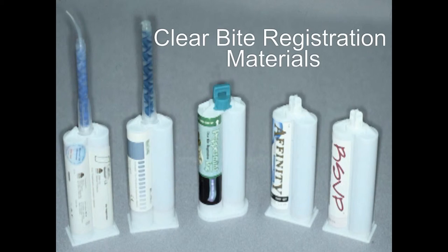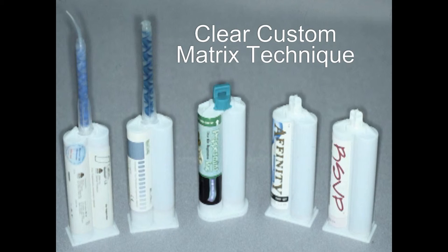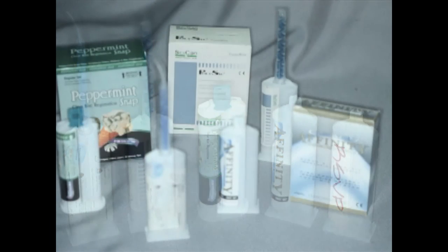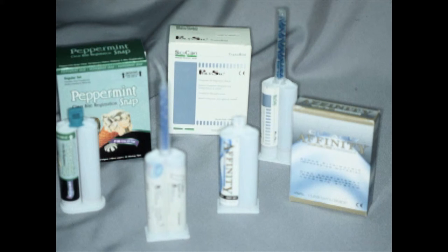Every material I've used here is a polyvinyl siloxane bite registration material — it's not made specifically for this technique, it's made for bite registrations. Because most of this material is sold for bite registrations, you only use a milliliter or two to make what is called a custom matrix. I don't push any one particular material — they all work. I would pick one with a short working time, because you don't need a long working time to take this type of impression.